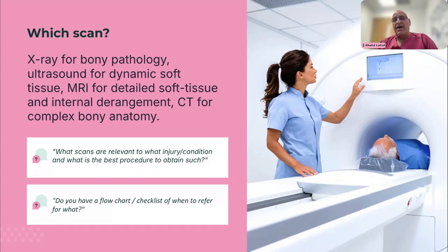So you look at the spine, you look at the fractures, and if they've had a very bad spinal injury and they've got neurology, which a lot of patients do because they've injured the spinal cord, you want to know what the spinal cord injury looks like, where it is. And for that, for the soft tissue details, you would need an MRI scan to look at the cord, and the soft tissue, the ligaments around there as well. So that's what you would do in that scenario.